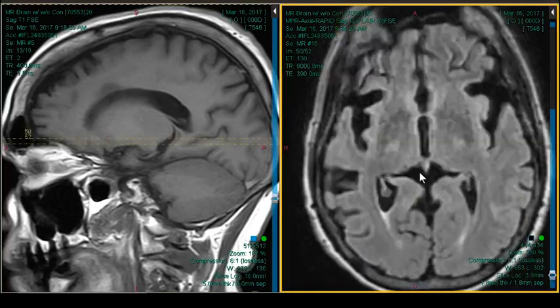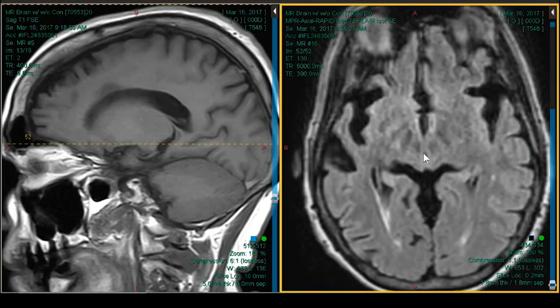Let me just make a couple more points, just for your dementia search pattern. Dr. Pomerantz mentioned this. So here's your brain iron, here's your red nucleus, your zona compacta stripe. So that's part of it. Now, we don't have the whole, we could look through a little better, but enough to say, could it be idiopathic Parkinson's? That can present with a dementia.